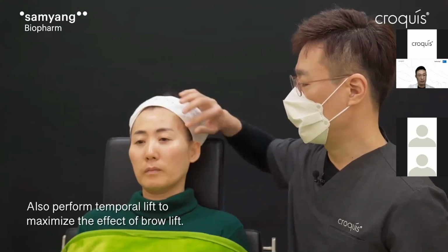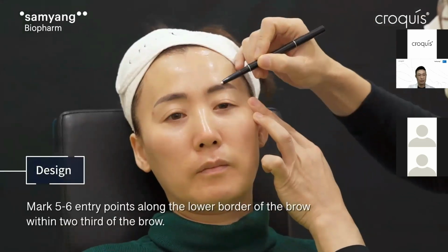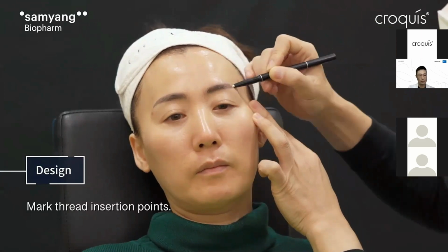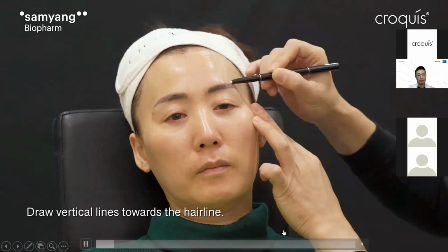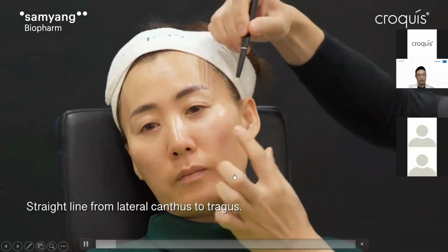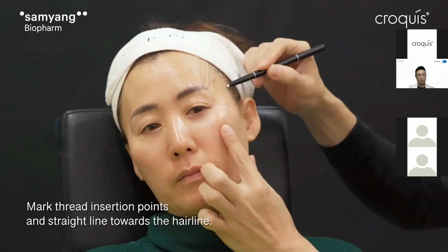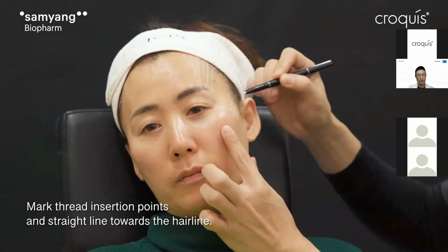And before starting treatment, you should check the asymmetry, and you should select the vectors and how many threads you will put. Usually, I start with the lateral part of the eyebrow, and I draw 5 to 6. And also, for this case, I combined temporal lifting to enhance the eyebrow lift results.